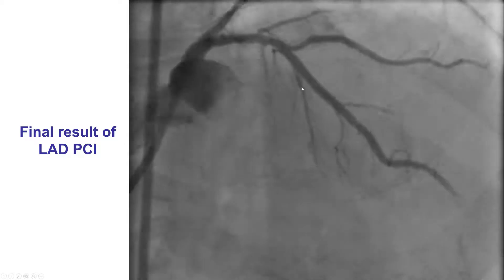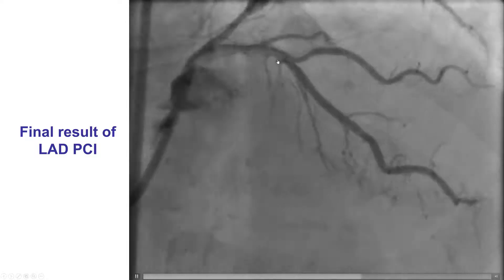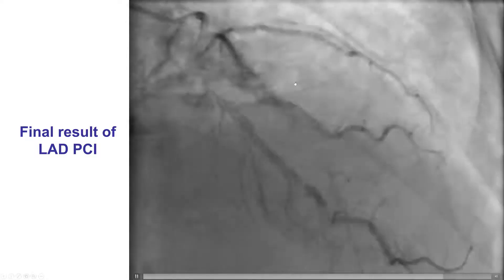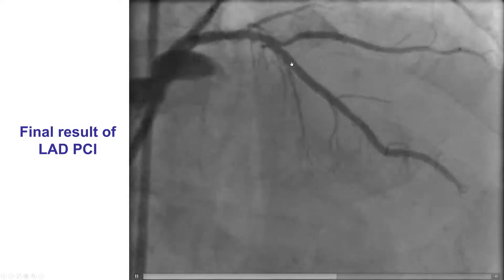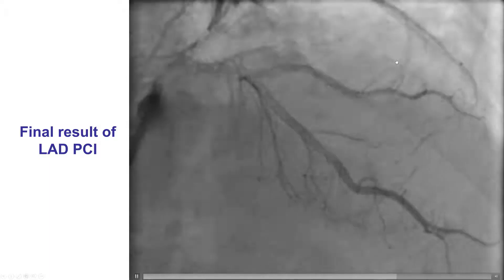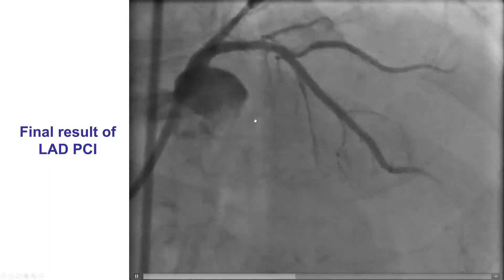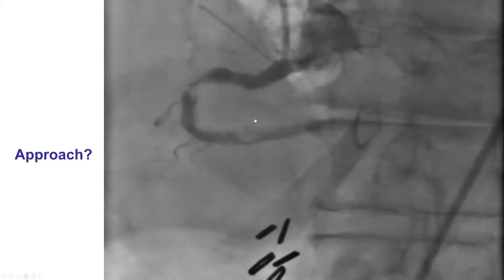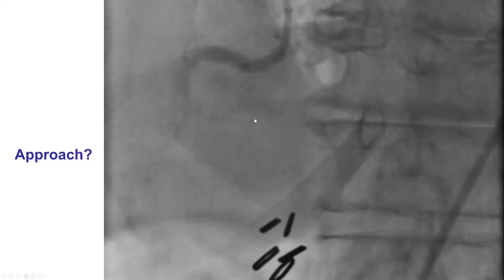Sometimes, if there is concern that the side branch is compromised, one option is to do a fractional flow reserve afterwards to determine the hemodynamic significance of any residual lesion in the ostium of the side branch. But in this particular case, this was considered a good result, and we therefore turned our attention to the right coronary artery.